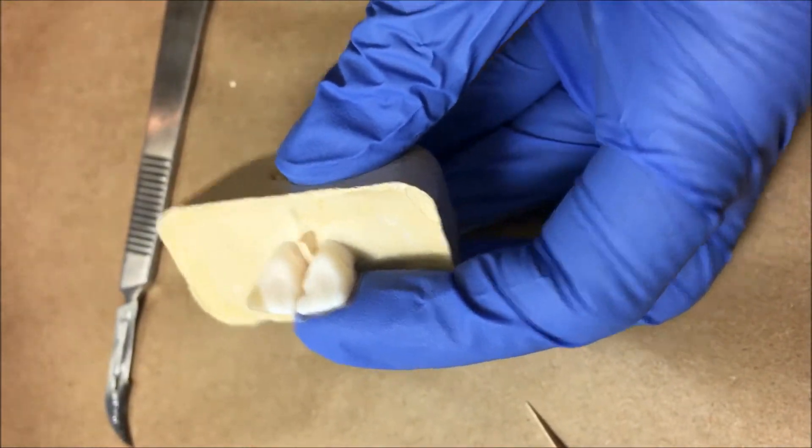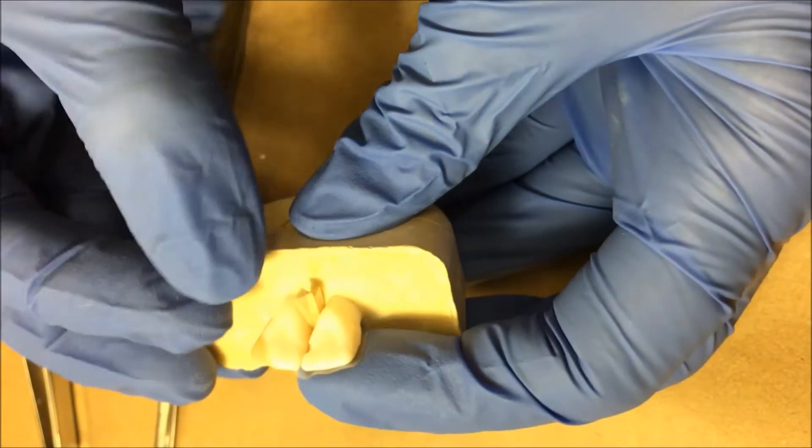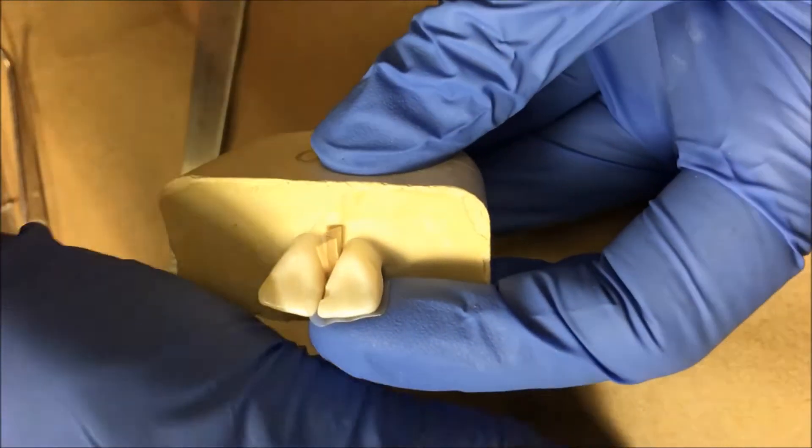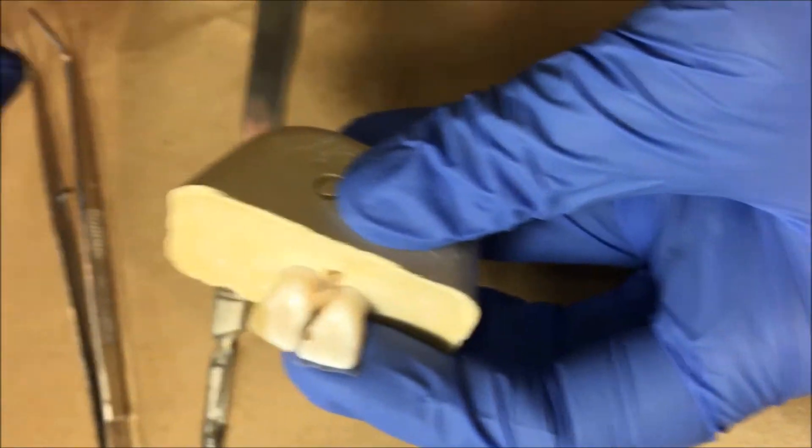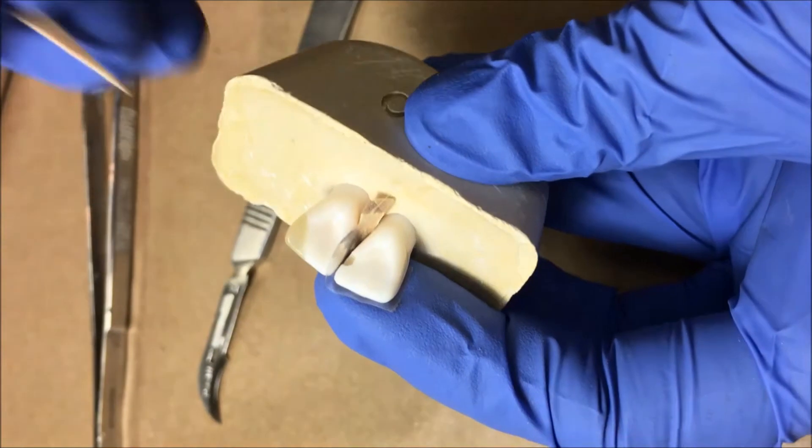These things fly you guys. I may be better just to use my fingers in this case. Stack again and then now this last one. I'm getting up to that point where I would actually be on a real patient that had gingiva and bone and all that.